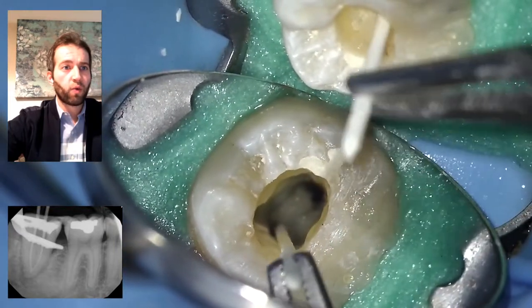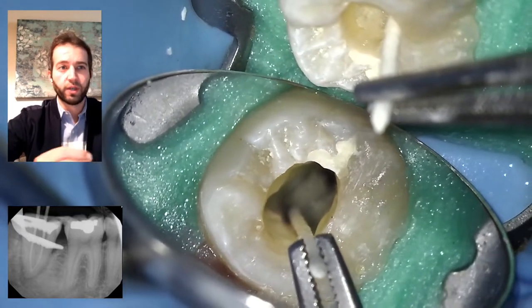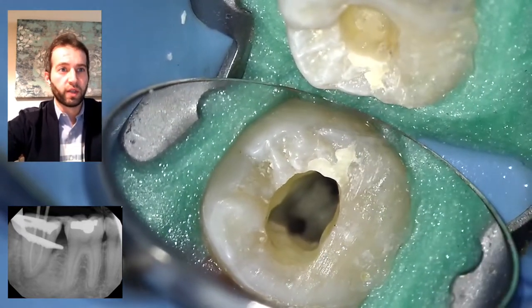I go back one more time with sterile paper points, because between the time I'm taking the radiograph some fluid can go in — just to make sure everything is nice and dry before obturation.